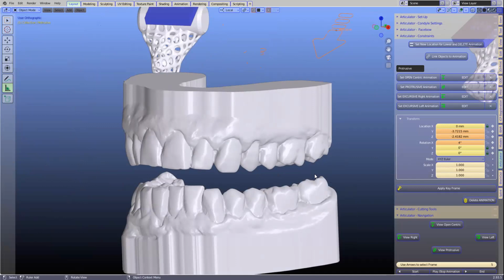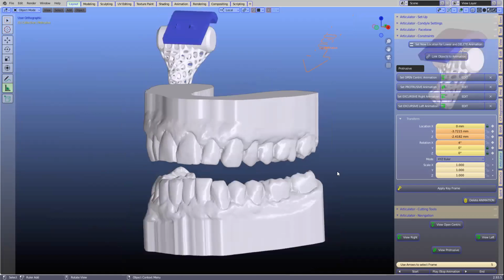You printed yours out of nylon, isn't it? So we can go way thinner than 2 millimeters. Yeah, 1.5 even. And of course, the SLS nylon is extremely tough. There's no biting through it. It's amazing. The only thing though is that you don't really get that complete smooth finish with the SLS printing. The particles are laser sintered together, but you can pumice it, and it's still comfortable by all means. But yeah, this is important.